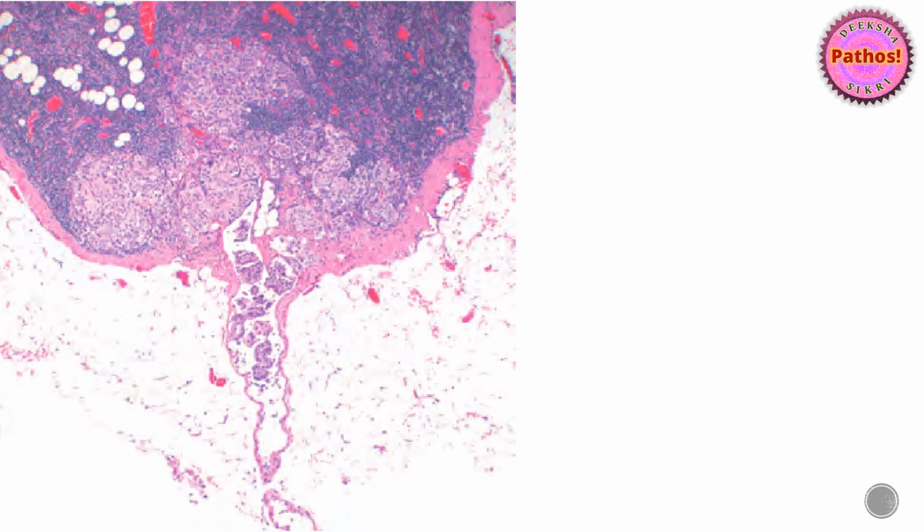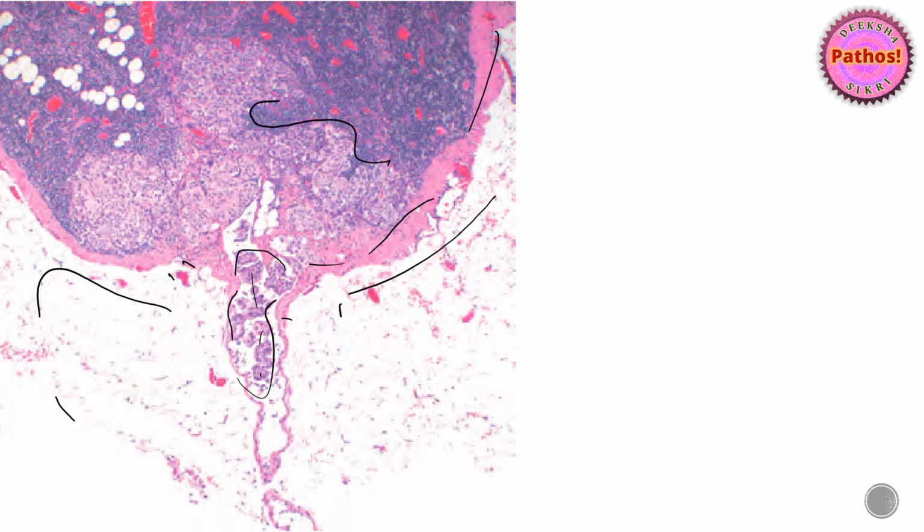This is another photograph. You can again see a lot of fat here, a couple of blood vessels, the capsule. And you can see that here within the capsule, or in the subcapsular sinus, there seem to be nests of cells, right? Immediately you can make out that they have abundant cytoplasm. That's why they are pink and they look abnormal compared to the rest of the lymphocyte population. So you can see this has gone further in, right? So again, this is an example of metastasis.